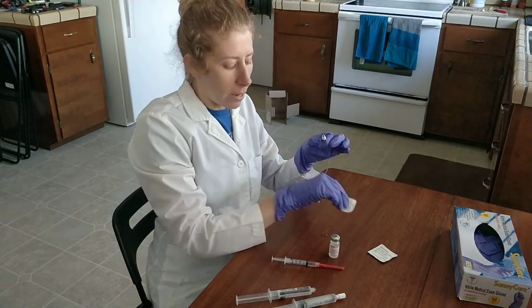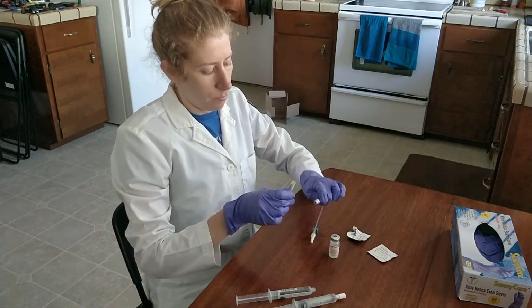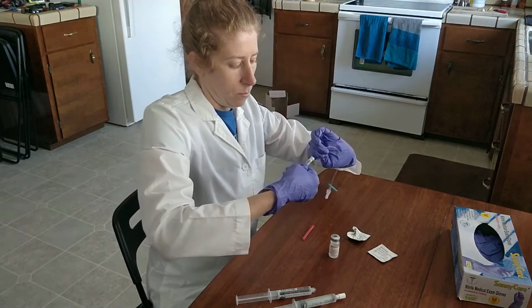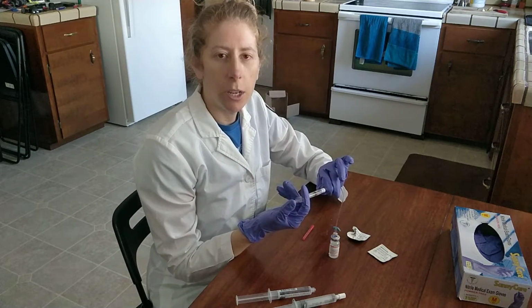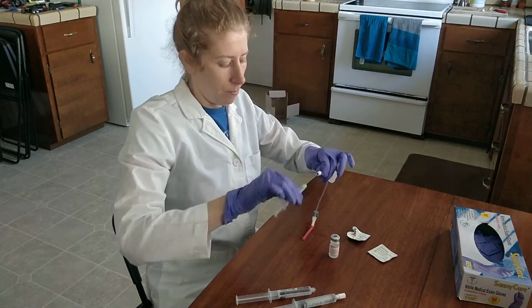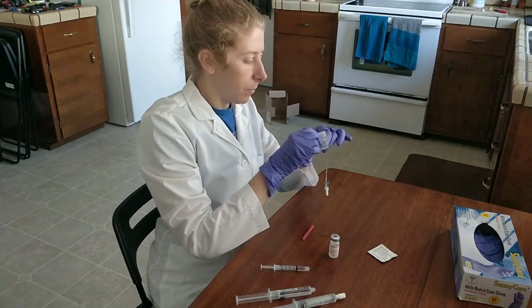I'll cleanse the port again. Attach the medication, and I will push it at the rate per minute that I calculated for this medication. Cleanse my port again.